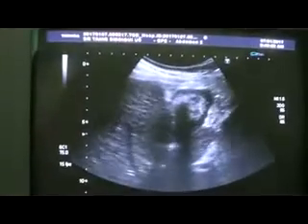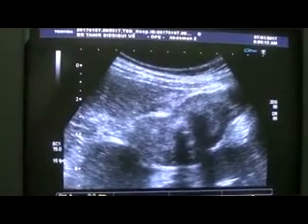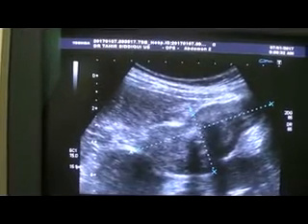Concentrate on the gallbladder. This is the gallbladder. You can see the outer surface is intact. The outer anterior wall is not thick. However, the lumen of the gallbladder is full of thick, non-mobile sludge with suspended calculi.